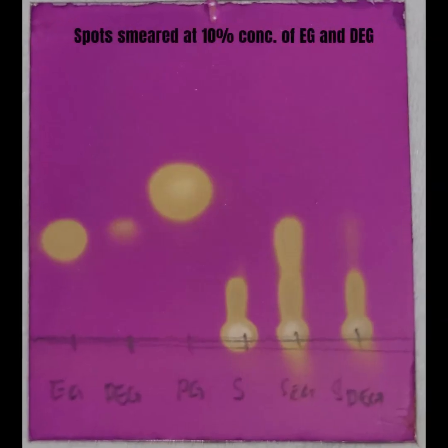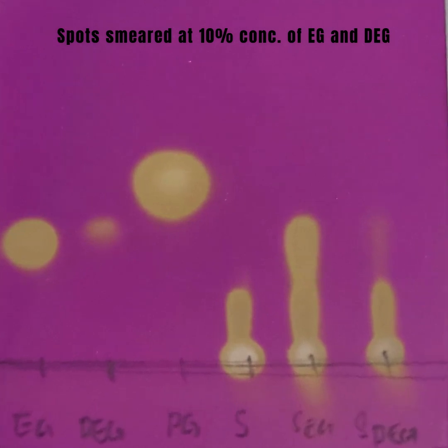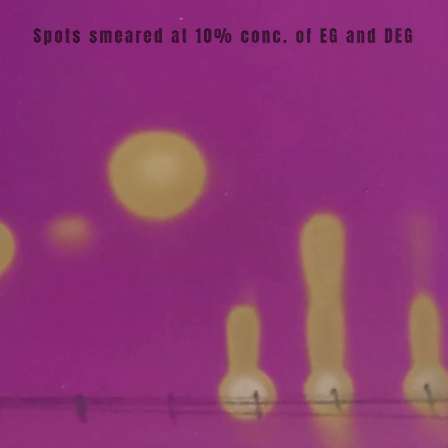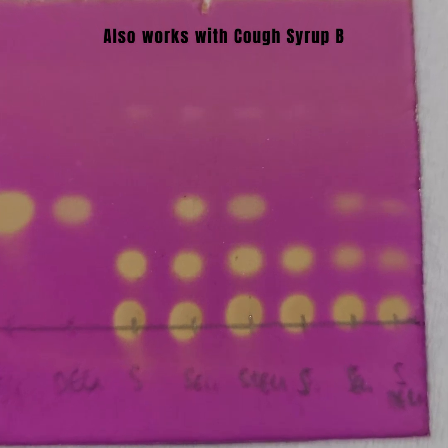However, at high concentrations of 10%, the spots smudge and may lead to difficulties in interpreting the results. It is best to dilute the samples should one encounter this problem. Lastly, this method also works on cough syrup B.